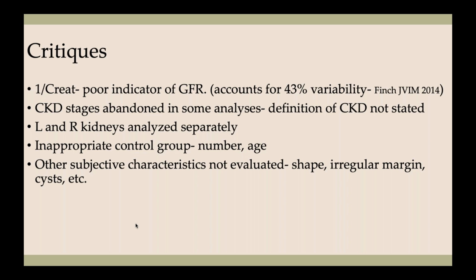I think they gave way too much data by looking at left and right kidneys individually, and they should have just looked at maximum and minimum of both kidneys combined. They could have done a better job with their control group.